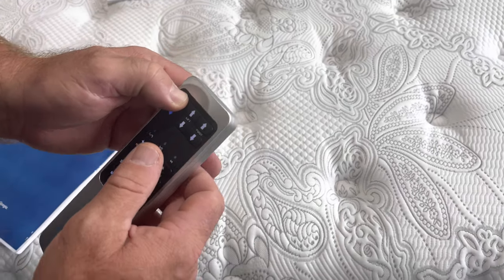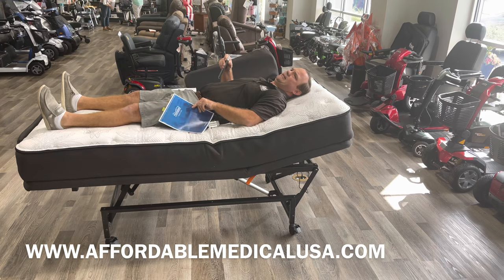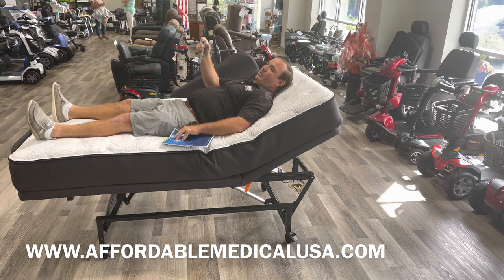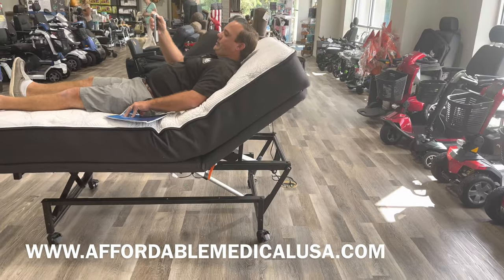You can raise the head, and you can order the bed in different lengths — I think a 76, an 80, an 84, and an 80 standard. Just like any hospital bed, you can bring the head up and you can bring the foot up.